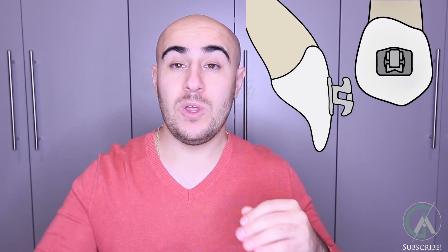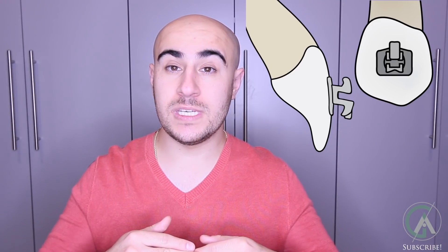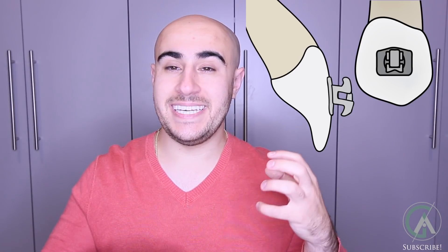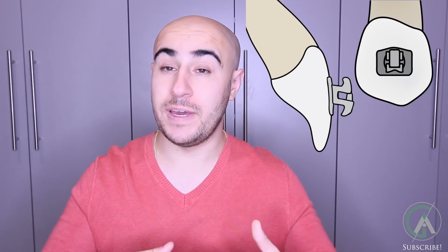The third type of way that we can individually tie in teeth are self-ligating brackets. I don't have an example for that, but I will do a little drawing right here. The way these brackets work is that there's a little door that opens and closes whenever you need to take the wire in and out. Whenever the wire is put in, the door is shut, and that allows for the wire to be ligated or tied into the bracket, which results in the tooth moving.